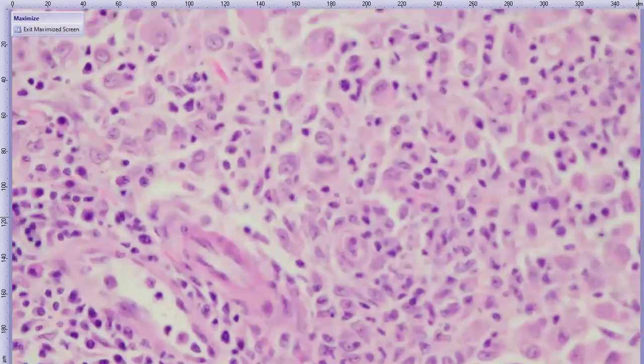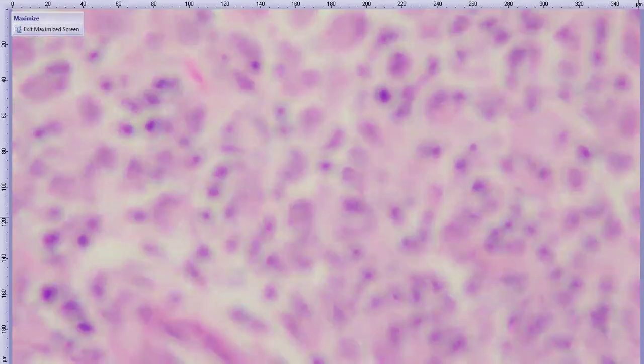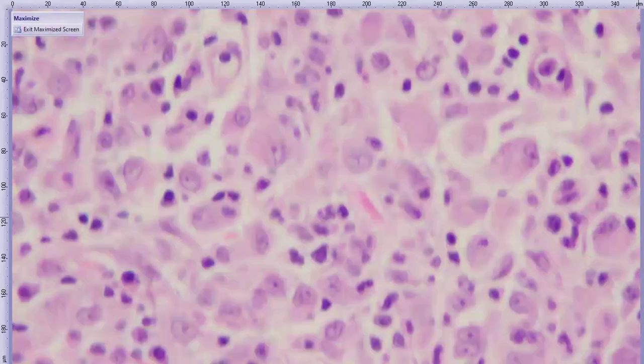Do you have a 16 on this one? We do. Yeah, of course. I can stop here even.